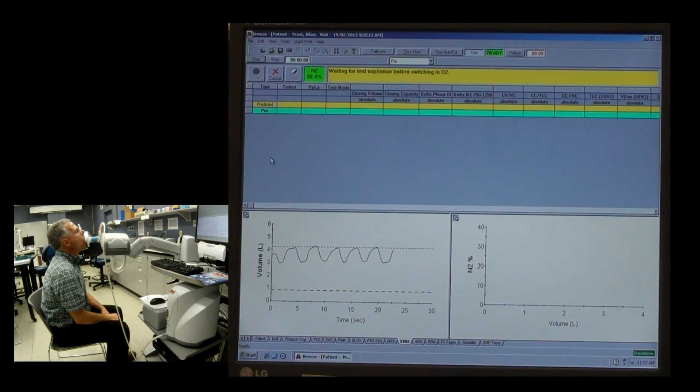So this is the one now. Breathing it out, breathing it out. Now breathing in, trying to follow along the inspiratory flow — just a nice, gentle, easy flow in now. Keep breathing in as much as you can, keeping in as much as you can, trying to get to that dotted line. That's about 85% of VC.